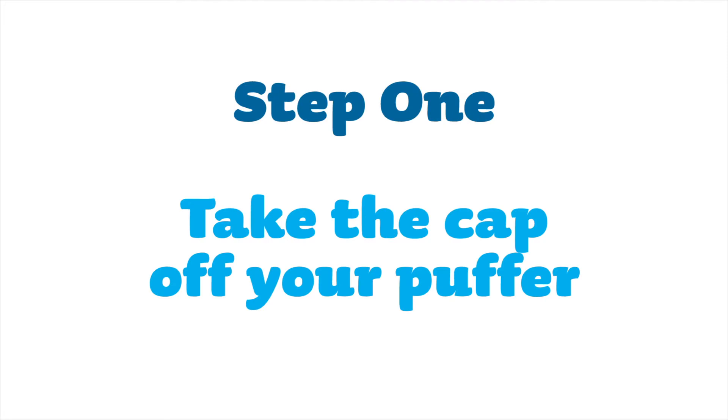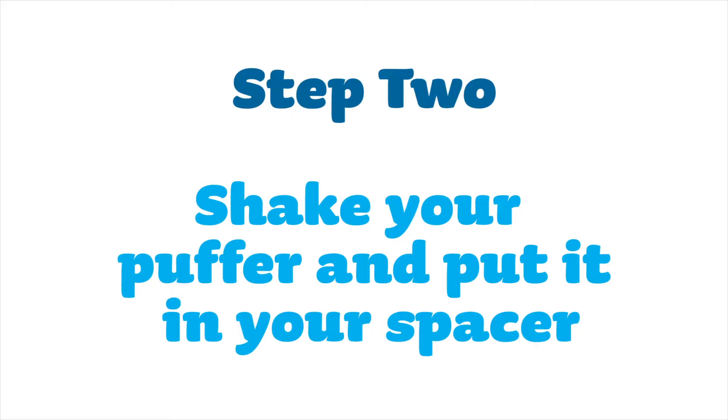Take the cap off your puffer. Shake your puffer and put it in your spacer.